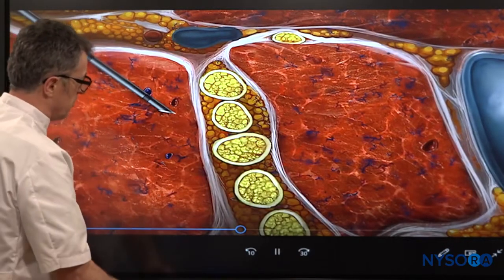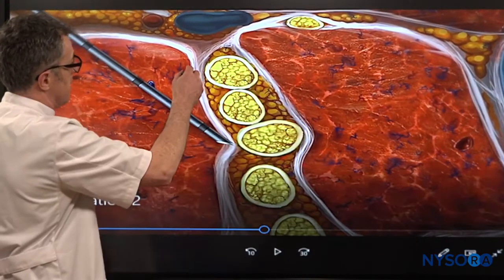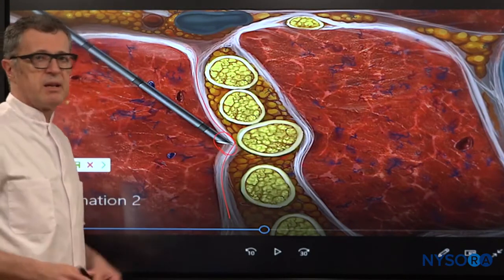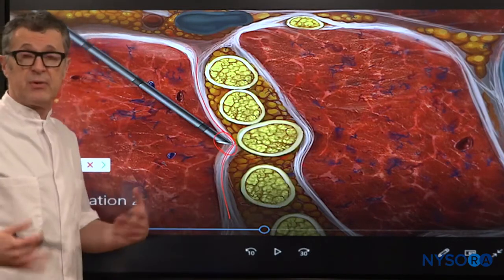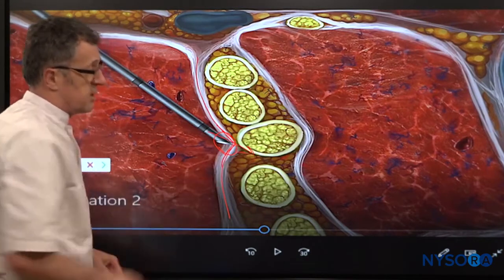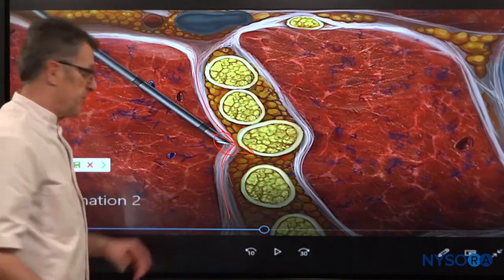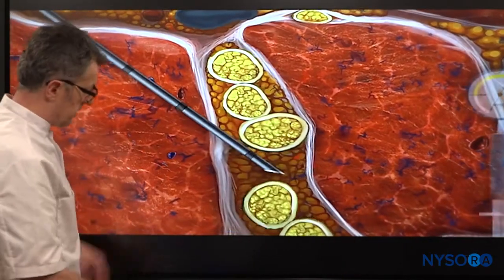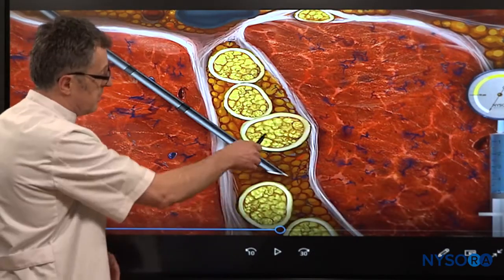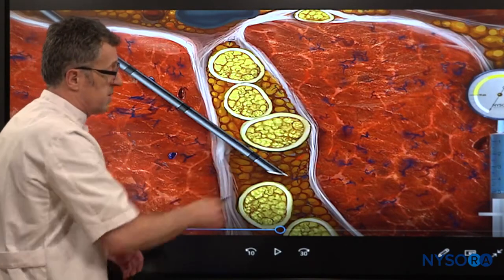And as the needle now approaches the brachial plexus sheath, again, it has to engage another tough fascial sheath. And as the needle is fighting and bending and distorting, engaging that fascial sheath, eventually it gives in. And as it gives in, the needle again tends to pop into the interscalene brachial plexus uncontrollably. And let's see this. As the needle passes through the brachial plexus sheath, again, it may come in violently.